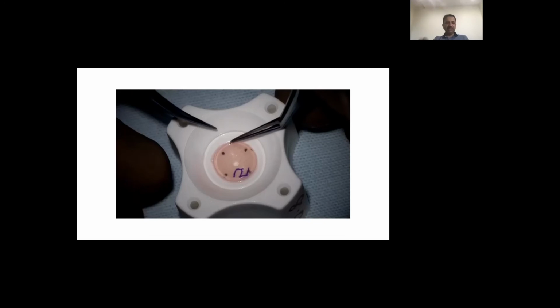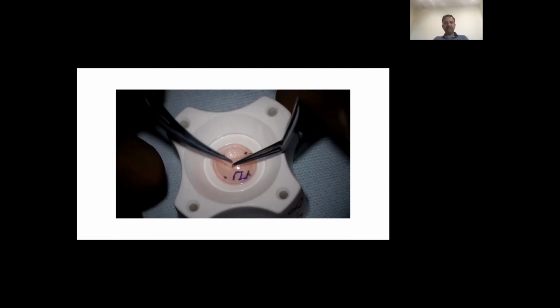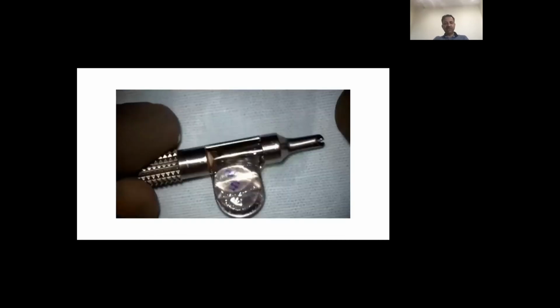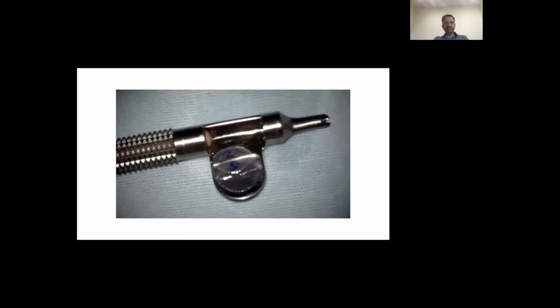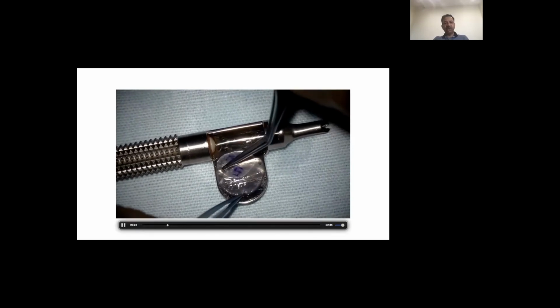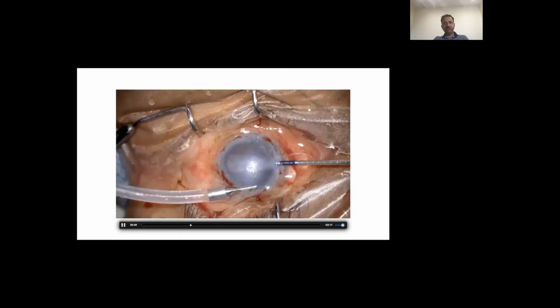In terms of inserting it into the eye, it's much more floppier than a DSEK graft because it doesn't have enough stromal tissue. So what we do is, before we transfer it to the injector, we do an endo in trifold with a little bit of cohesive viscoelastic in the center, and then we transfer it to our inserter. Because without doing that, if you try to shift, the tissue has a tendency to curl on the endothelial side.